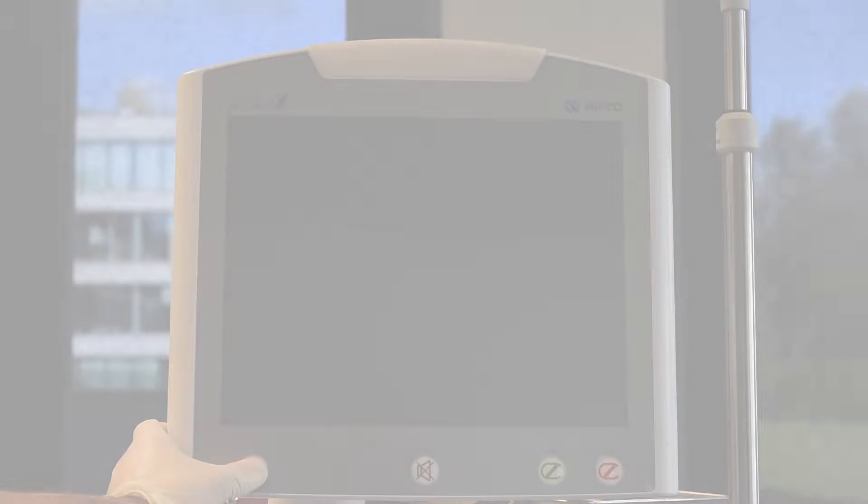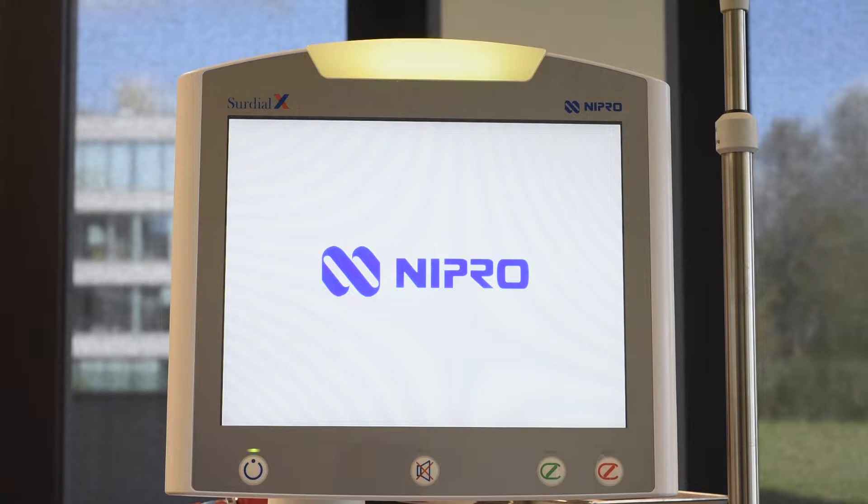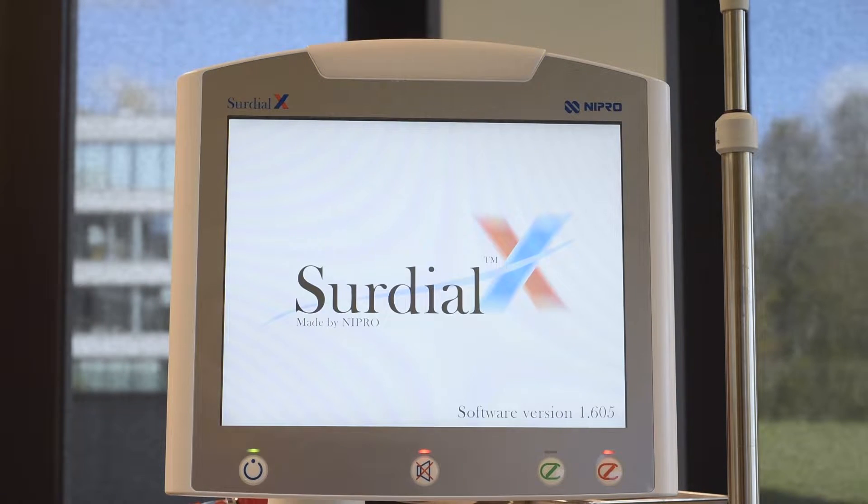To turn on the machine, please press the power button until the light comes on. The machine will show the Nipro logo followed by the Sodial X screen. The used software version is found in the bottom right corner.